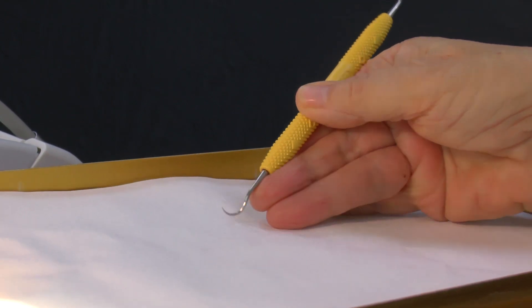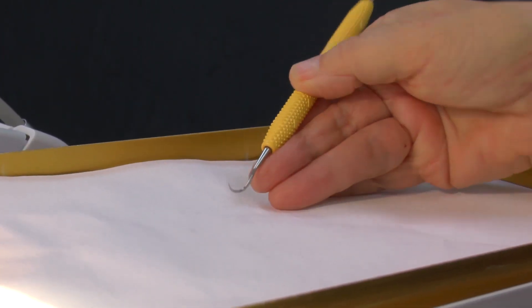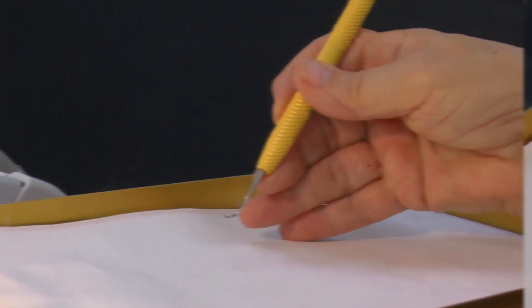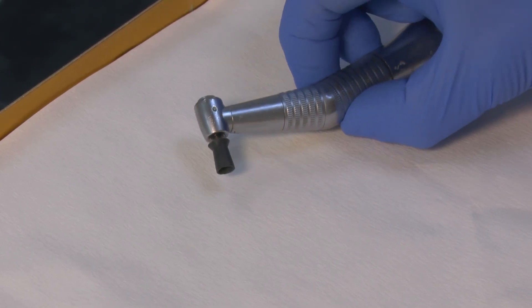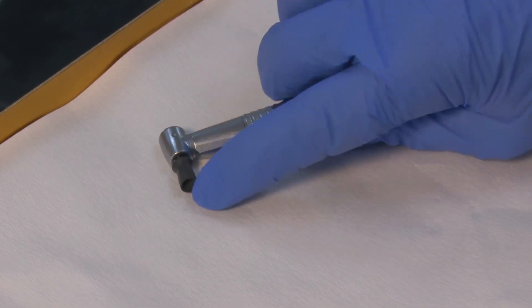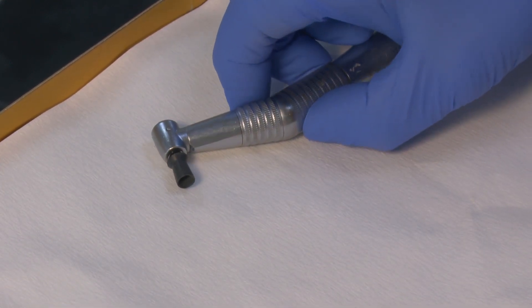If you're going to do hand scaling without getting tired, you need to use the power of your arm rather than the power of your fingers. This is the normal handpiece and soft rubber cup that would be recommended, because the rim goes subgingivally — but that's not the only one that can be used.